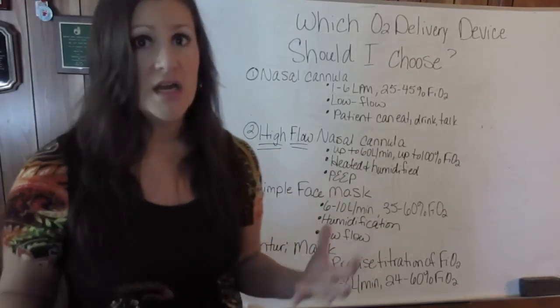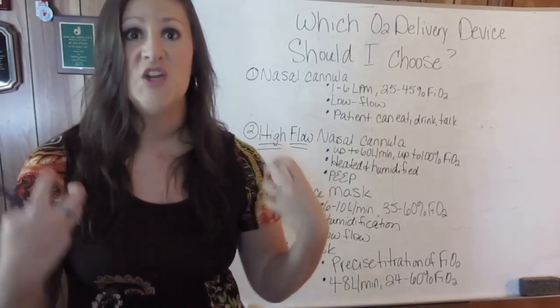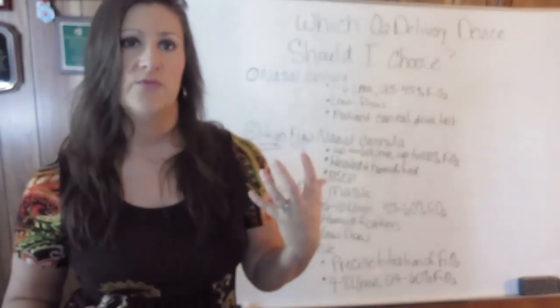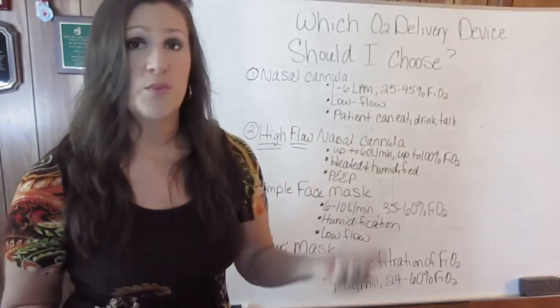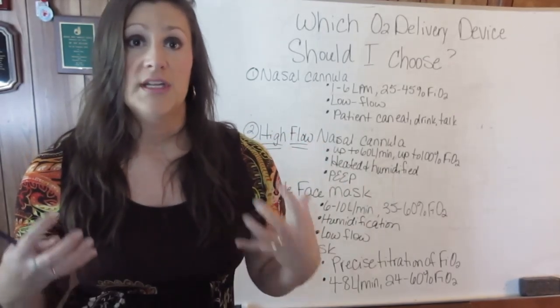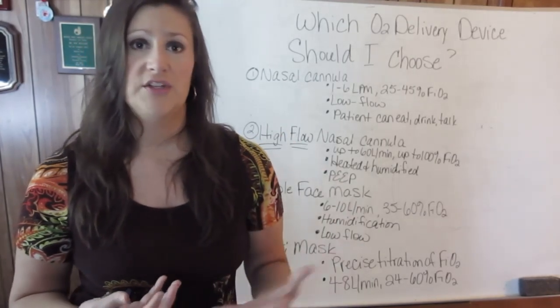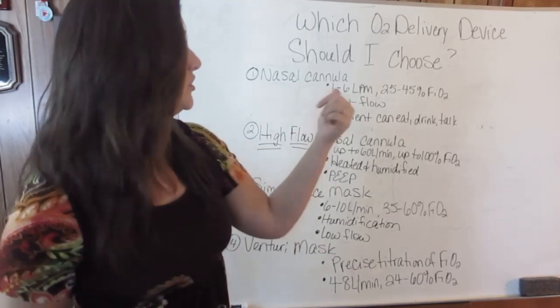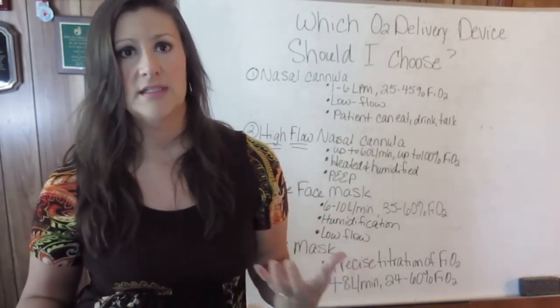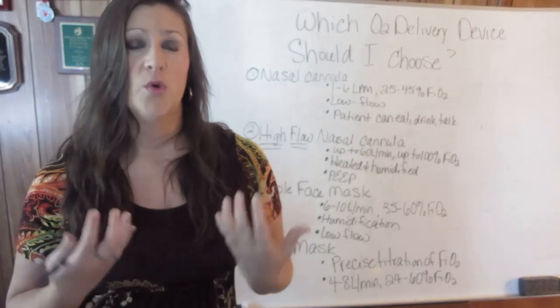The high flow, because it is giving such high flow rates, is already heated and humidified, which does wonders for the patient's nasal passages as far as preventing them from drying out. That's a huge problem with just your standard nasal cannula. You know that oxygen is very, very drying to the nasal passages. That can be a big problem, especially for patients on blood thinners. That oxygen from the nasal cannula can start drying out those nasal passages and they can start having nosebleeds and things like that. Now you can add humidification to a nasal cannula, which I do recommend.